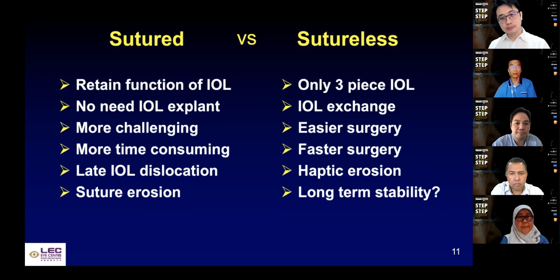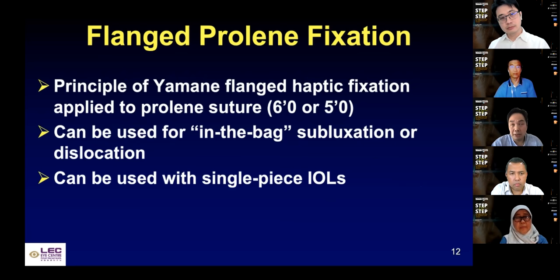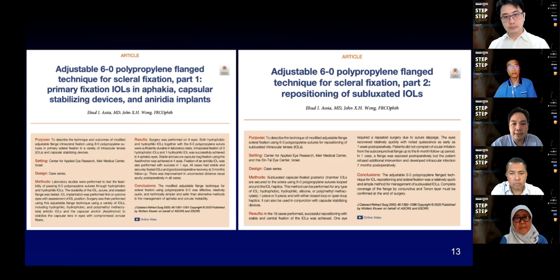So as I mentioned, flange Prolene fixation is still new. If you look at the publications, it probably came up in the last year or maybe 14, 15 months. Canabrava started out with it, and I'll share some of his videos. It uses the same principle as Yamane did, but instead of putting low heat cautery to a PMMA or PVDF haptic, using it for Prolene, and this time 6-0 or 5-0. So these are the publications that I looked at, and these two papers from Ehud Assia from Israel and Dr. John Wong from Singapore very nicely highlight the uses that you can put this flange Prolene technique to. Part one, if you have aphakia, and of course part two, to rescue lenses.